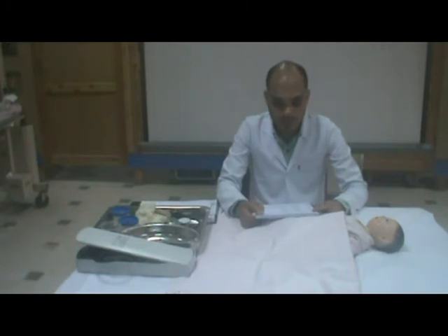Methods of measuring body temperature in infants and children. First method, rectal method. Temperature range from 37 to 37.8. Advantages: safe for newborns who are unable to cooperate and may bite the thermometer. Not directly influenced by the ingestion of hot or cold fluids. Method of choice if a child has seizure or breathing difficulties, is receiving oxygen therapy, or has oral surgery. Disadvantages: values may be altered by presence of stool.